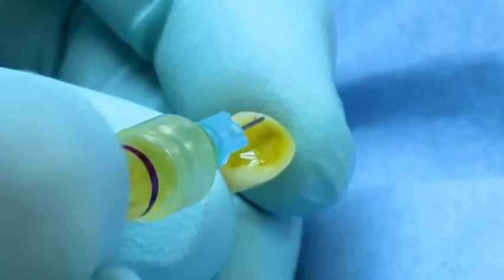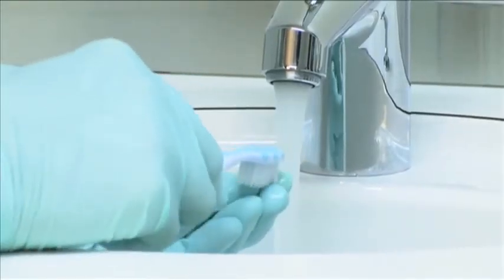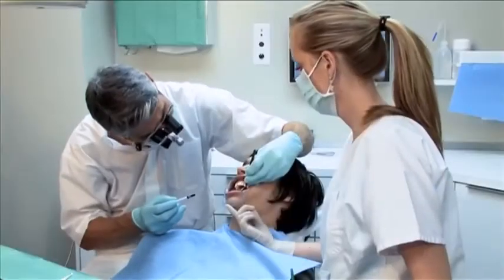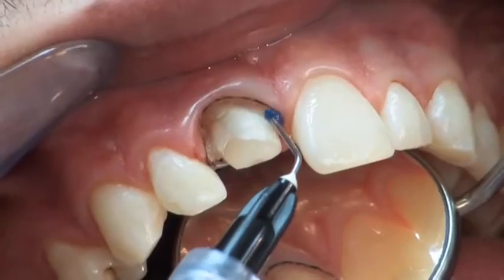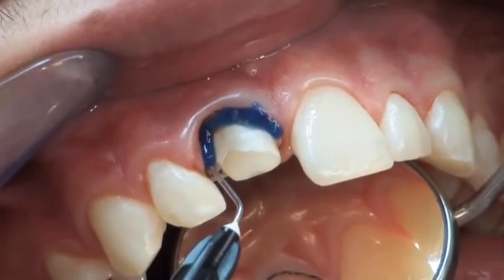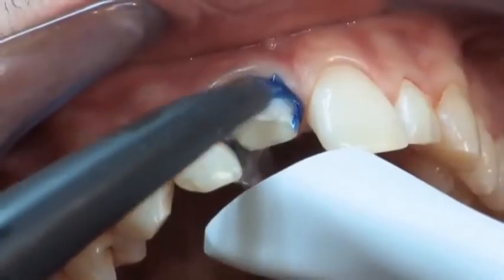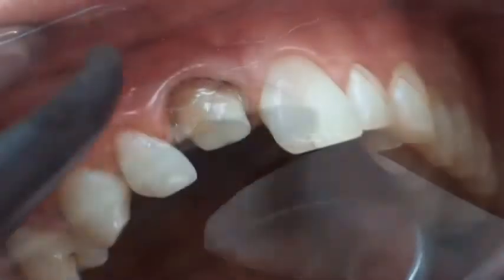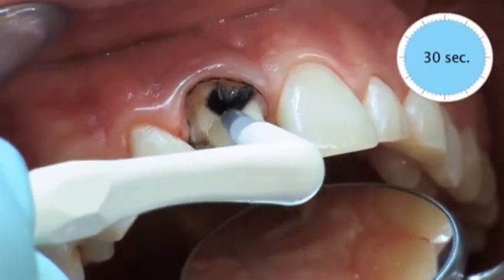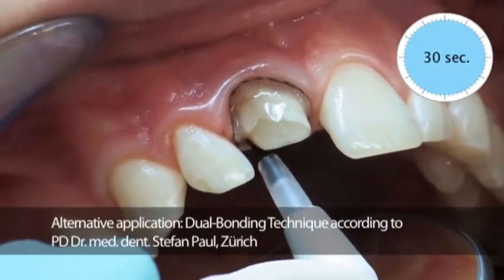Before cementation, the inner surface of the crown is etched with hydrofluoric acid, cleaned under running water, and dried. The etched surfaces are silanized and thoroughly dried. Etching around the margins of the preparation using 35% phosphoric acid is performed. The etchant gel is rinsed off thoroughly and the tooth is gently dried. Re-application of Parabond adhesive shortly before the final cementation significantly increases the retention of the Paracore cement.